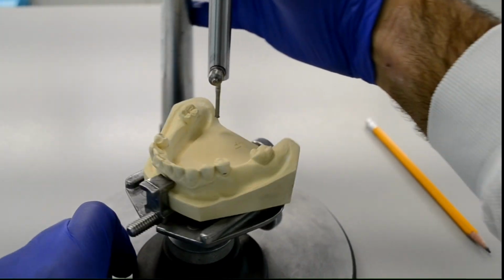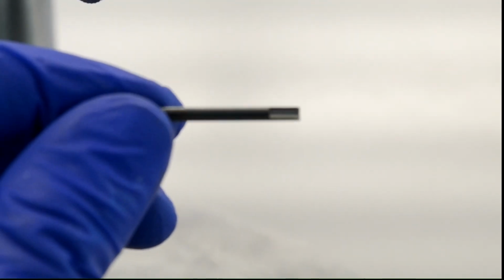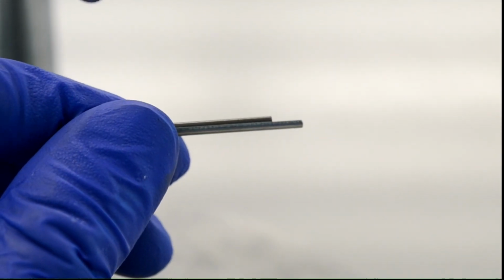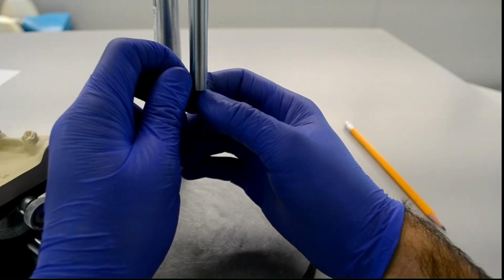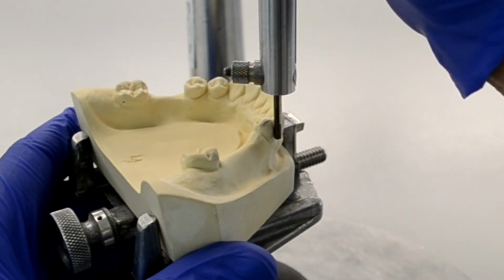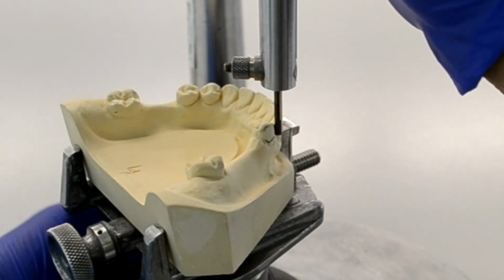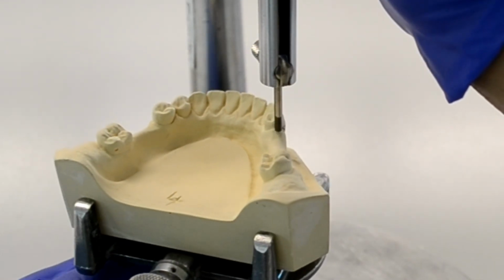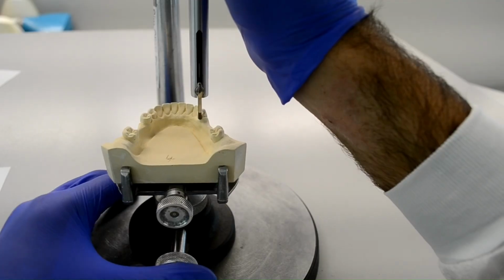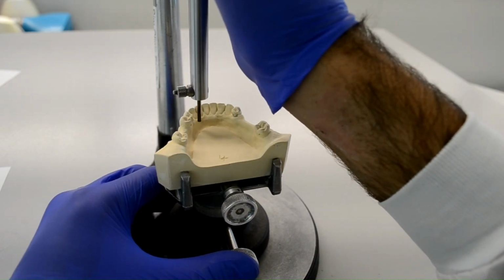Now that we're done identifying all the different undercuts, it's time to draw the survey line. This is done using the lead and the metal sleeve. They're both attached together and then attached to the mandrel. To correctly draw the survey line, we're going to ensure that only the side of the lead contacts the tooth and not the tip. The side of the lead is rubbed against the highest contour of each tooth, and that leaves a line called the survey line. Anything under that line represents a degree of undercut.